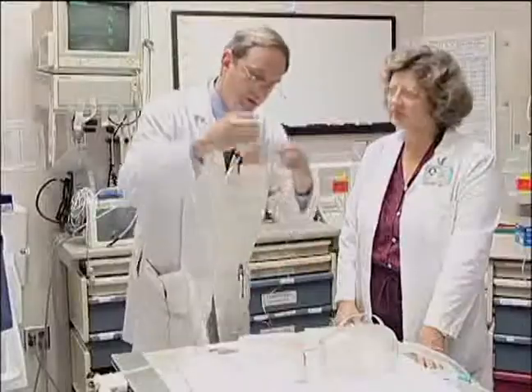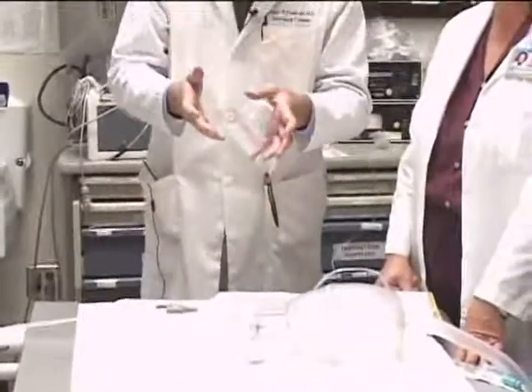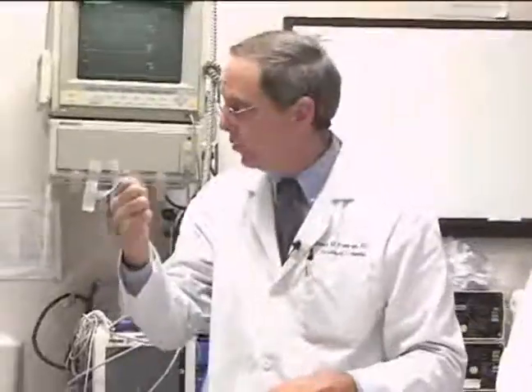So they're at high risk of aspiration. So Combi tube comes out, quick cricoid pressure, then come on very quickly with your mask and your ambu bag. I would suggest that before we even do that, we slide a nasal trumpet in the patient and have an oral pharyngeal airway available.